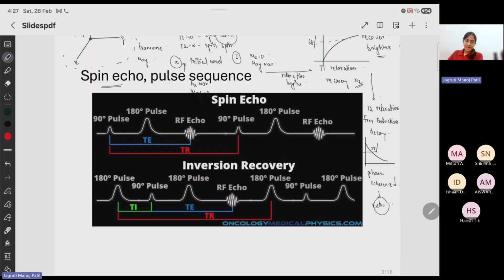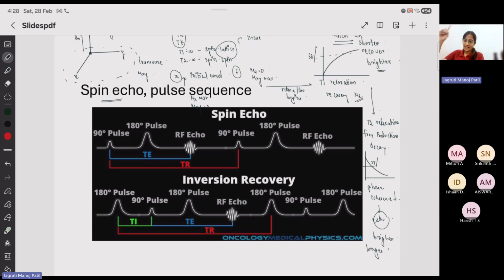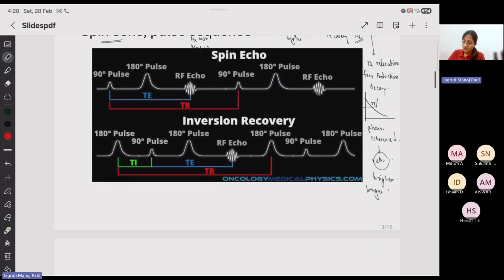Okay. So the longer the time it takes, the better for us, because we'll get signal until that time, and hence the ones which have a higher T2 will appear brighter. So always, T1 takes time to recover, whereas T2 takes time to decay. There's this simple rule that T1 is always greater than T2 because it takes more time to relax, whereas T2 takes less time to decay. But we want T2 to be larger so that our instrument is sensitive enough to detect the signal and measure it at that particular time.